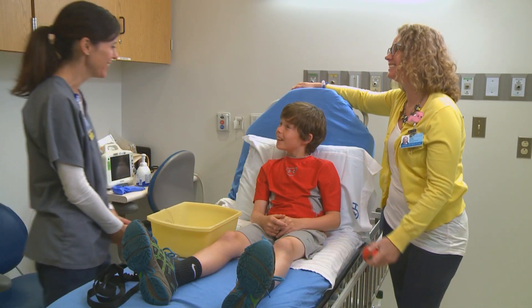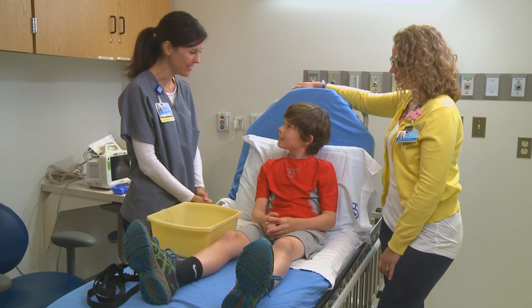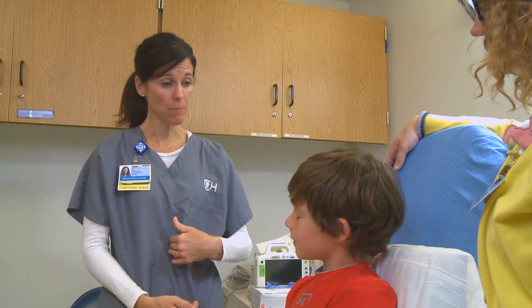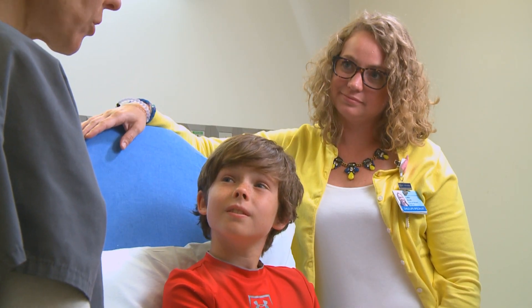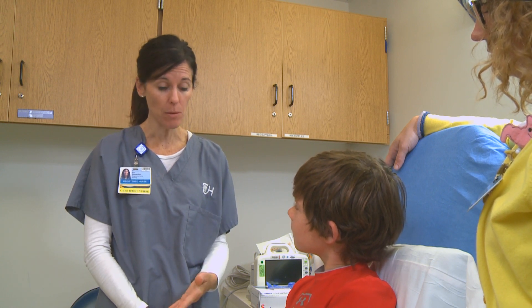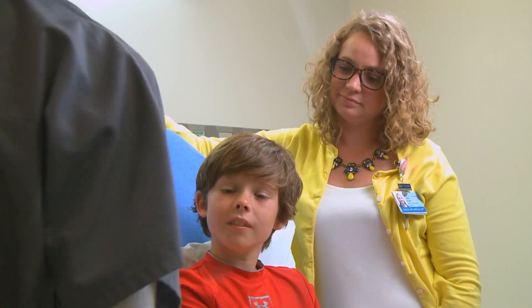Hi Brady, how are you? My name is Carrie. I'm one of the nurses in the endoscopy suite. I'm here today because sometimes after you eat, you have pain in your belly. So your doctor ordered something called an impedance pH study, and this study is going to help us find out what's going on after you eat.